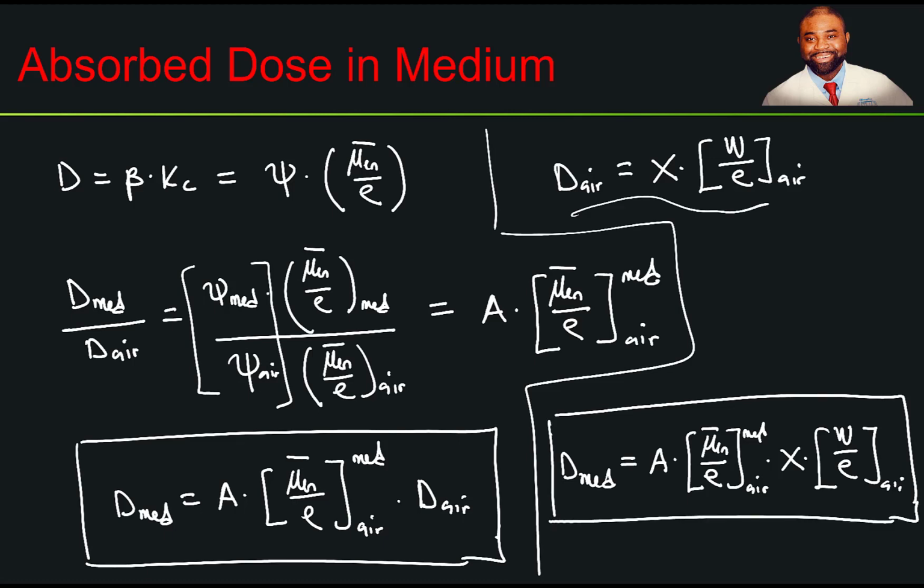And we're drawing closer and closer to the formulation in TG 21. But what you need to keep in mind is that this equation is only true provided charge-particle equilibrium exists.